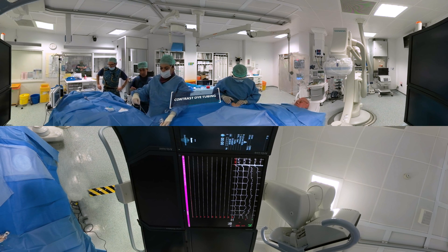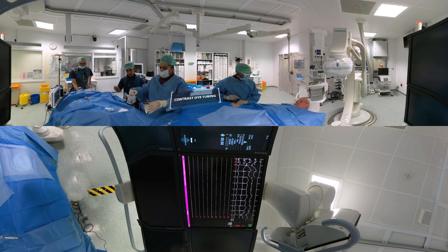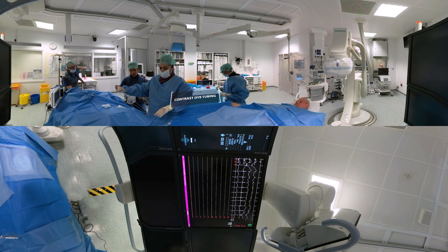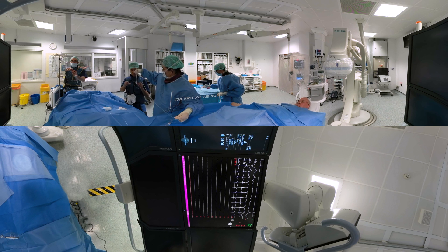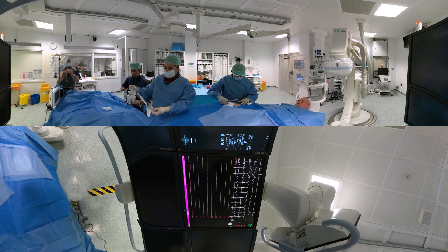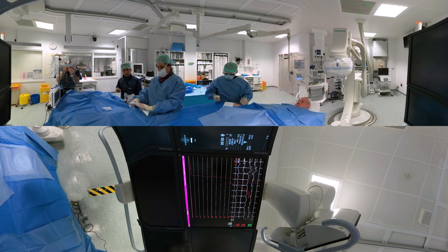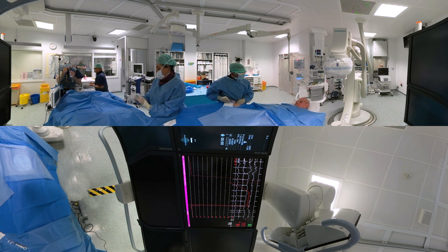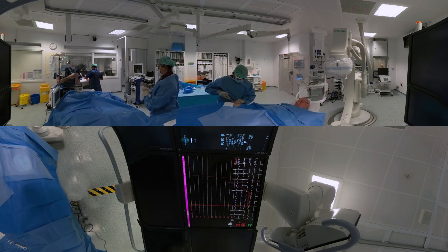The procedure is performed under local anaesthetic, and sometimes we give patients some sedation just to take the edge off. The local anaesthetic is just around the artery and works very quickly to numb the area. Next is a little tube that goes into the wrist artery. It's got a little valve on it so the blood doesn't leak out, but it allows us to pass our catheters up.